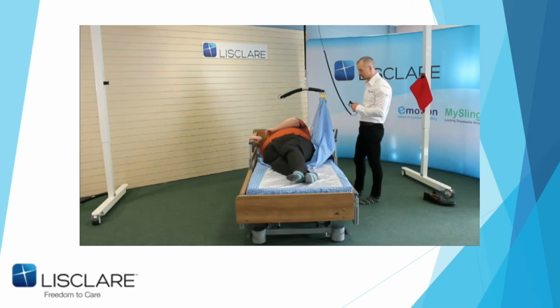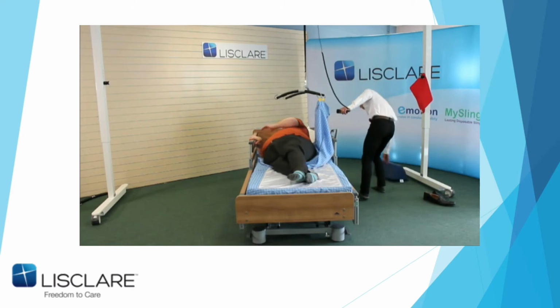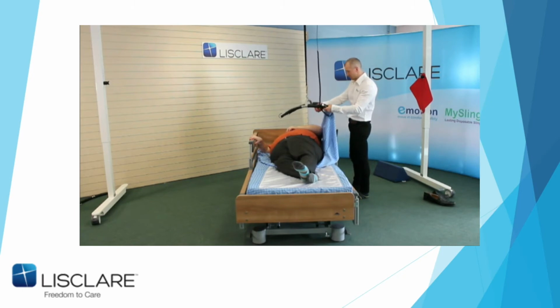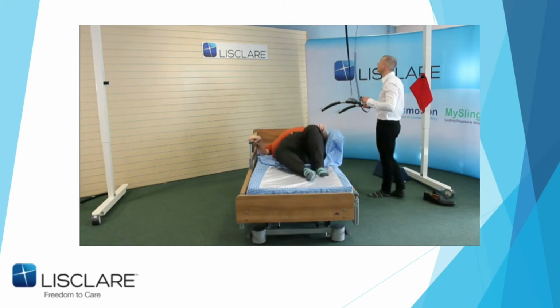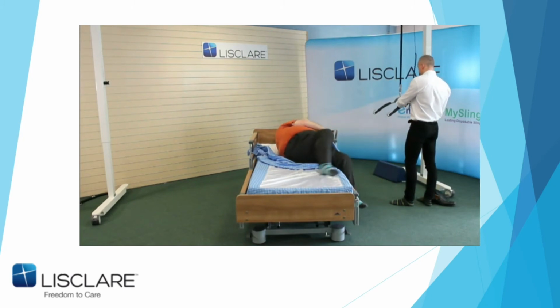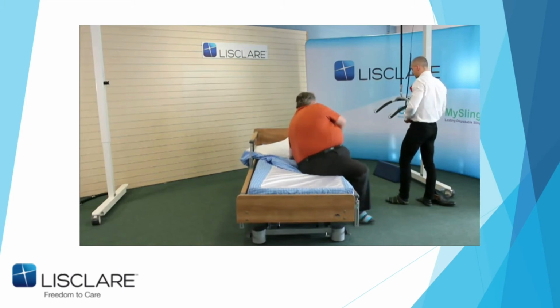So if John lowers that down, I'll help him out by leaning over. Thank you, John. So you want to release that. Now, one of the issues I mentioned to Stuart at the start, I know we make this look easy, but we do practice this a lot. And it's down to confidence. There we go.